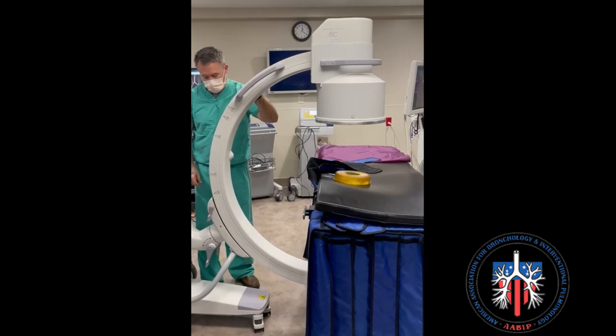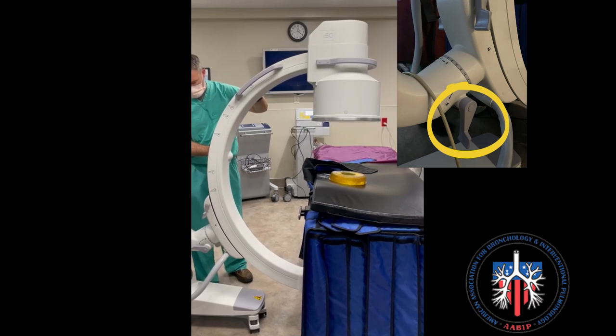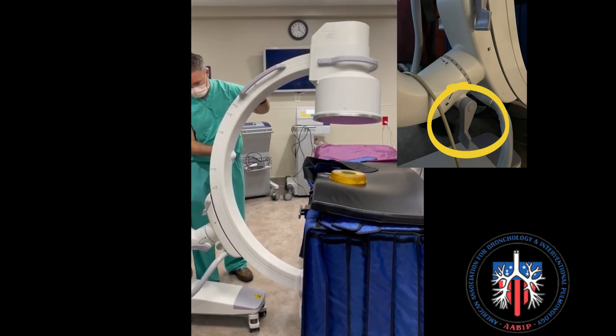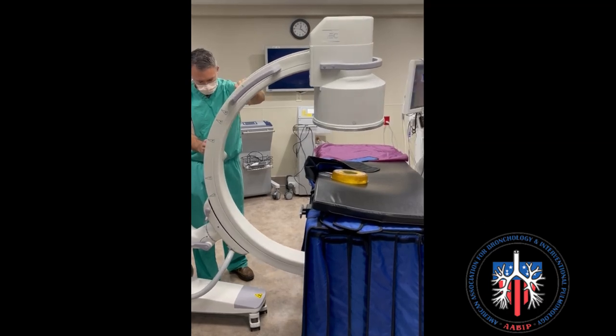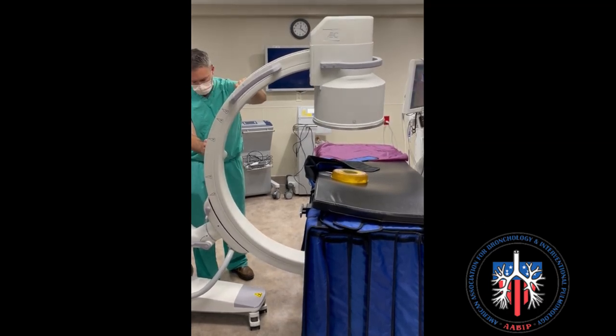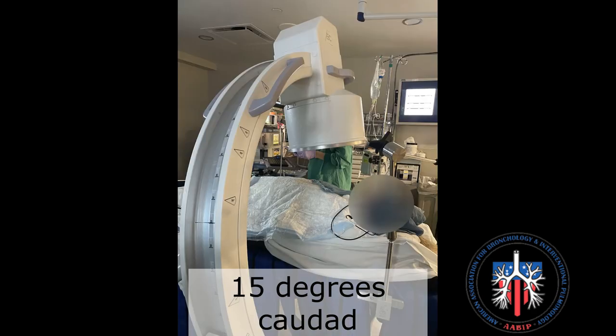The movements of the C-Arm are demonstrated here. To move the C-Arm tube caudad or cephalad, release this handle. The X-ray tube can then be rotated caudad and cephalad. Lock the C-Arm once the desired position is found. This is an example of the C-Arm tube positioned at 15 degrees caudad.